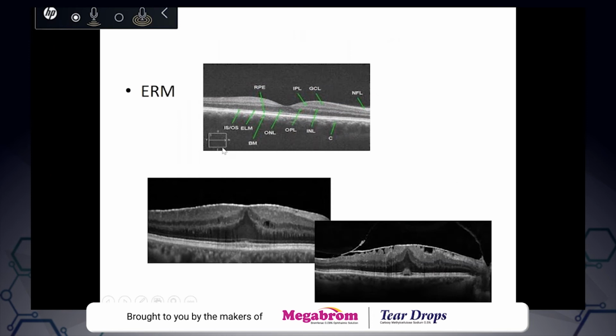So now you look at this. Another vitreomacular interface disorder is epiretinal membrane. You see a hyperreflective lesion on the surface of the retina. So this is epiretinal membrane. Normally you see the foveal depression should be here, and the outer plexiform layer and the nerve fiber layer should meet here. But here you are seeing everything is pulled toward the center. This is because of this epiretinal membrane pulling. You are not expecting all structures to come like this, but this is because of the epiretinal membrane pulling it.